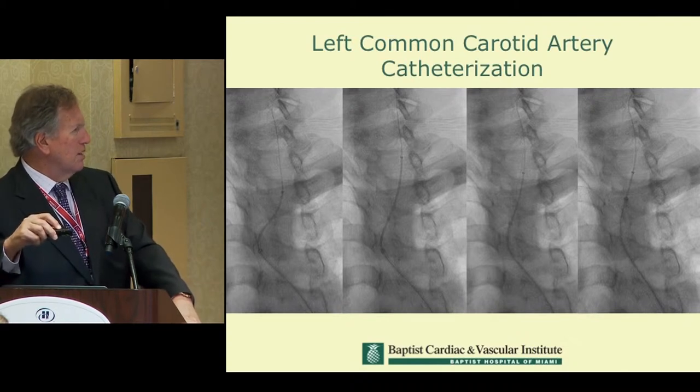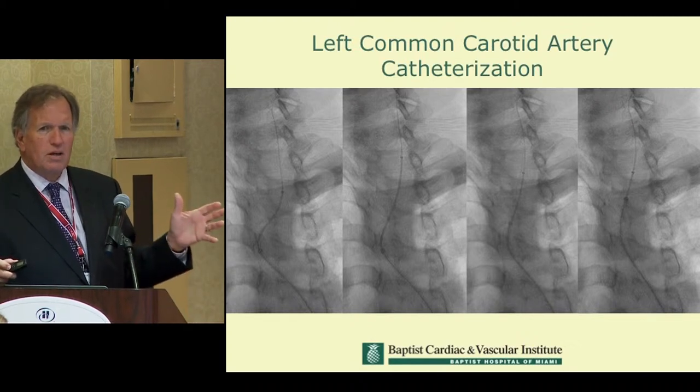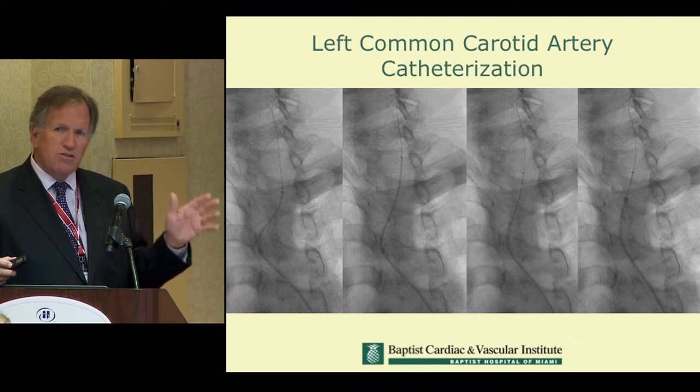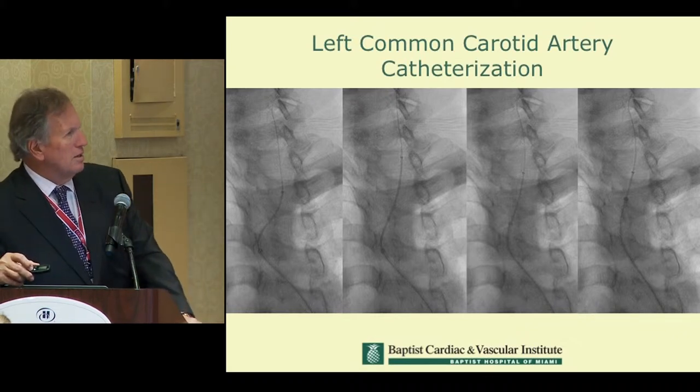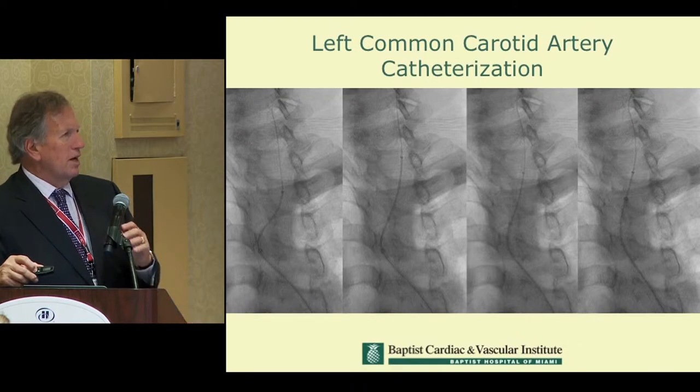Here you can see how the catheter looks, and how we're steering and advancing the wire and catheter up the left side. Look at the configuration of this catheter compared to what you'd expect with a Simmons 1 or SOS 1 — it's a very different, more direct and facile approach. With the same wire, the same catheter, and the same sheath, we got into both carotid arteries and treated one side with no change of catheters, despite the anatomic challenge.